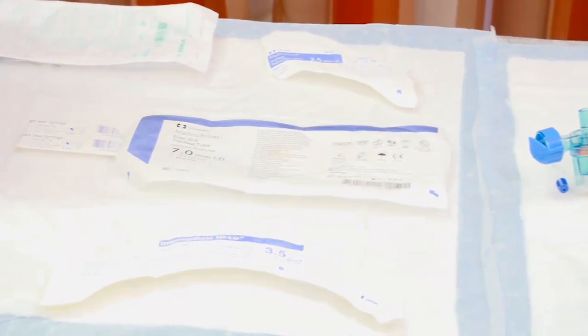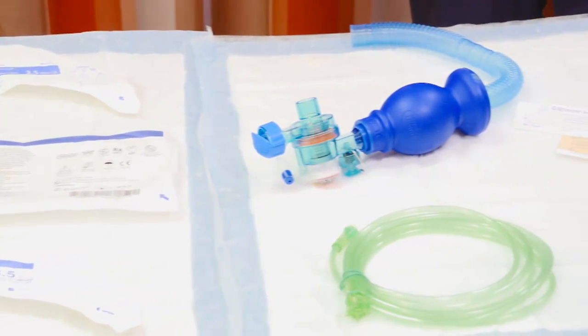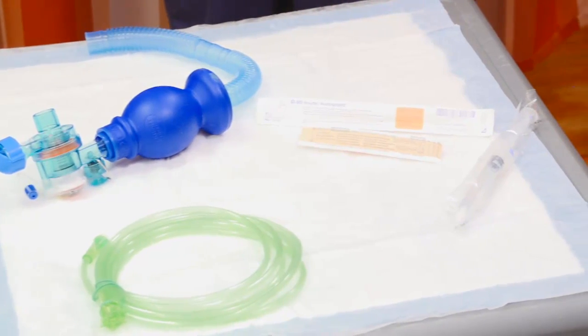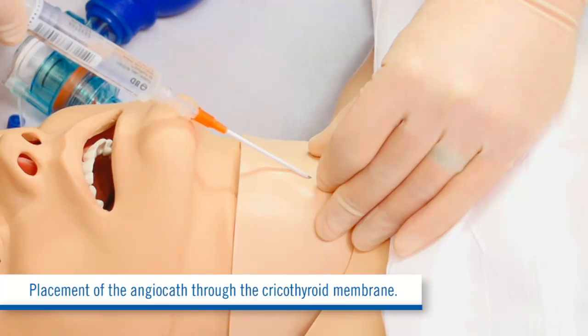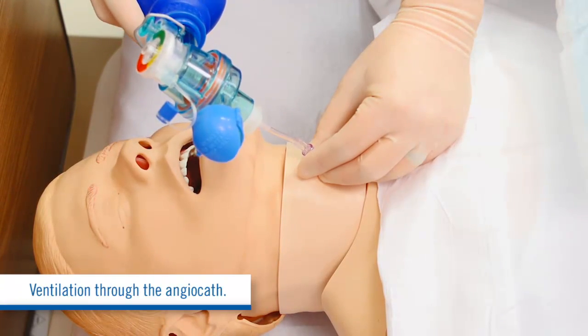This is what you need to perform the procedure. We endorse the use of items easily found in most emergency departments. I like to think of the procedure in 2 parts. Number 1, placement of the angiocath through the cricothyroid membrane. And number 2, ventilation through the angiocath.